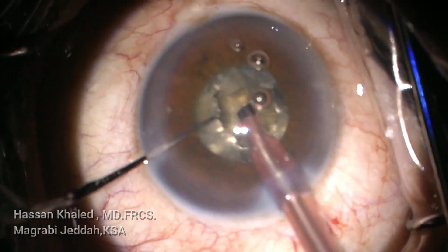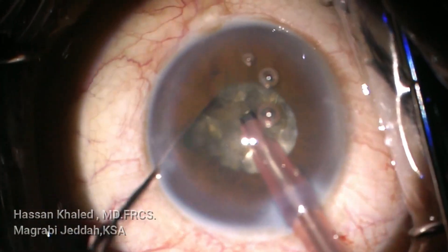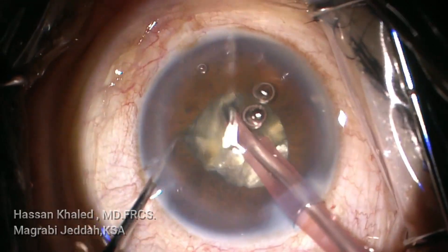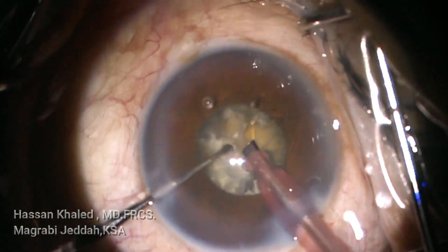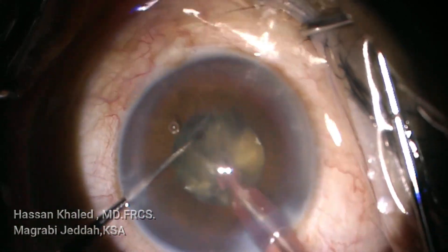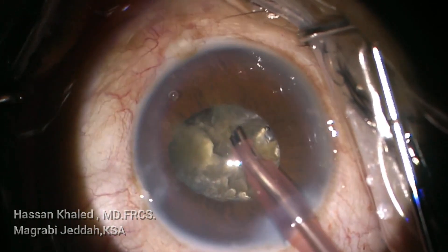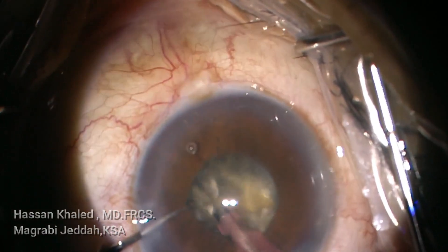Now just converting to torsional mode and emulsifying these dense pieces. The pupil is about 2.5 to 3 millimeters in diameter. In this dense cataract, it is crucial to inject dispersive OVD throughout the emulsification to protect the endothelium of the cornea. After doing the vertical chop, I changed the sharp pointed chopper to a blunt-tipped chopper, which is safer for the posterior capsule. You can hold each small piece and emulsify it just supranuclear at the level of the pupil with multiple injections of dispersive OVD to protect the corneal endothelium.